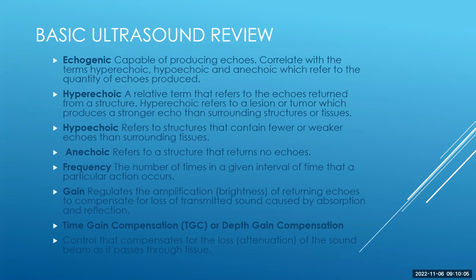Frequency is the number of times in a given interval that a particular action occurs. As we increase the frequency, we're sending more and more sound waves, and that's going to be useful for something more superficial, 1 to 3 centimeters in depth. Again, that's the target zone, if you will.